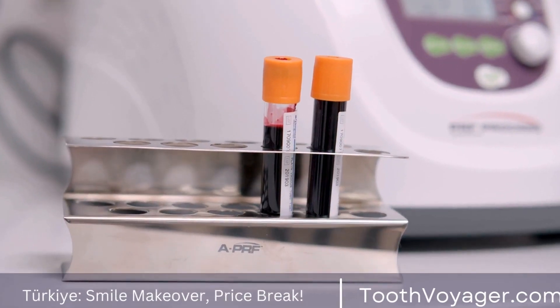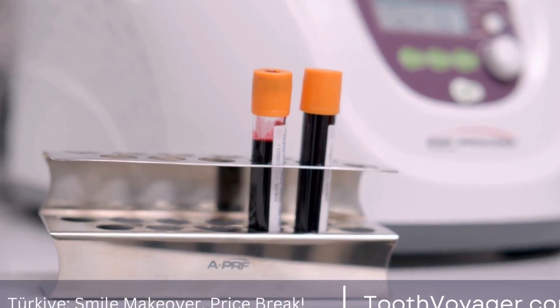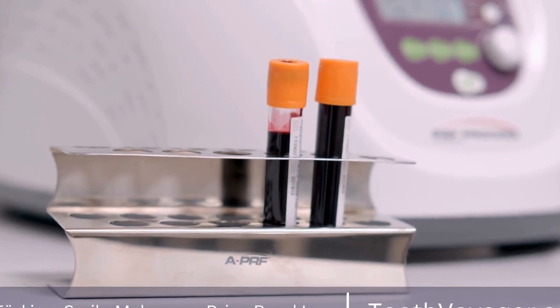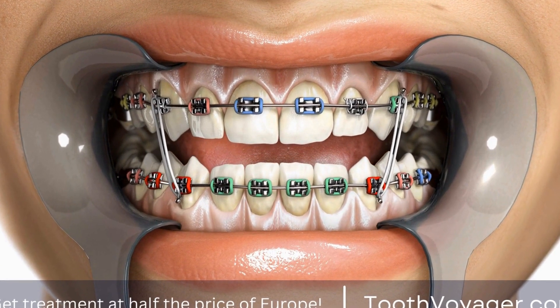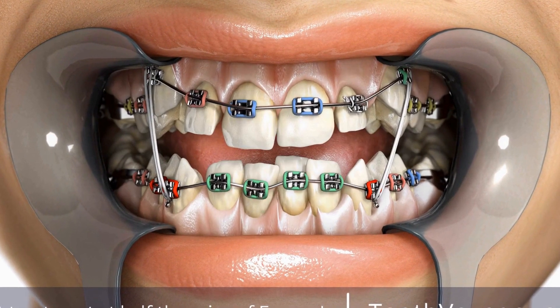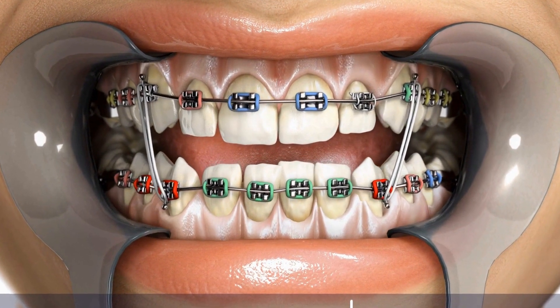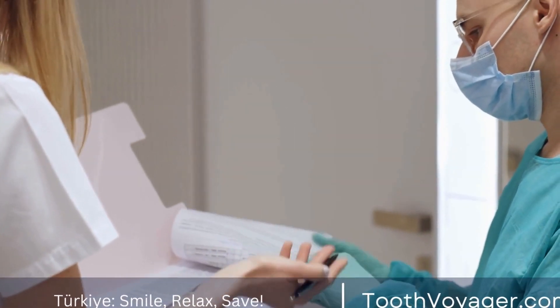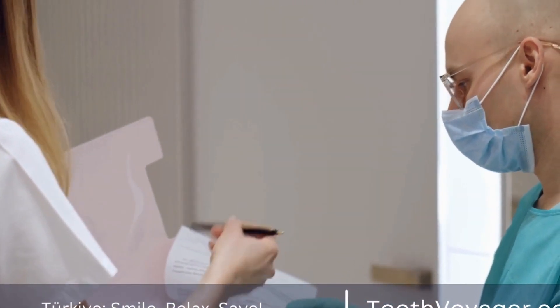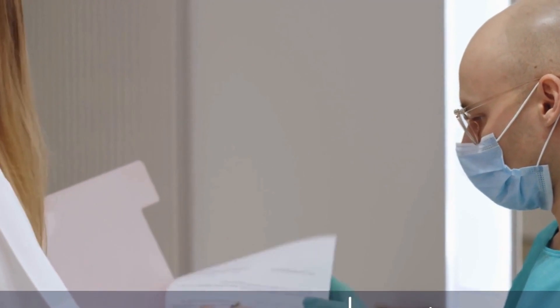In conclusion, crafting custom dental crowns is a blend of artistry and precision. Skilled technicians use advanced technology and careful attention to detail to create crowns that are not only functional but also beautiful. By understanding the process behind custom crowns, patients can better appreciate the skill and expertise that goes into restoring their smile.